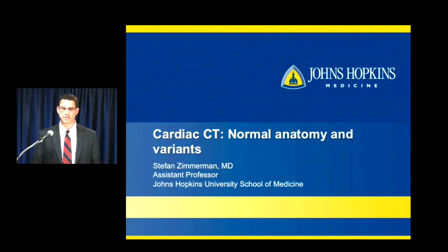Hello, my name is Stefan Zimmerman. I'm an assistant professor here at Johns Hopkins University in the Department of Radiology. And today we're going to talk about cardiac CT and review normal anatomy and variants.